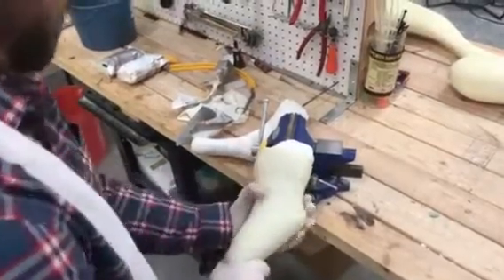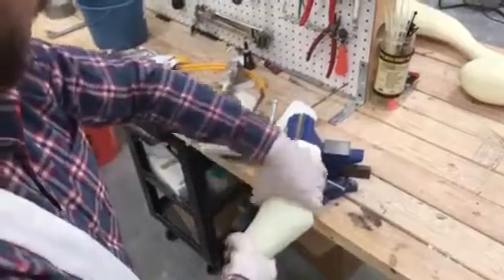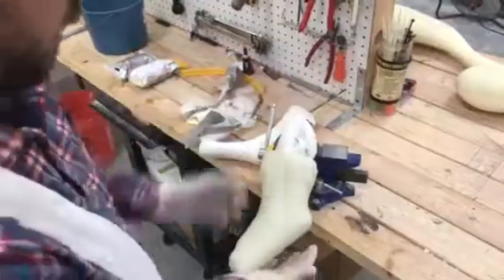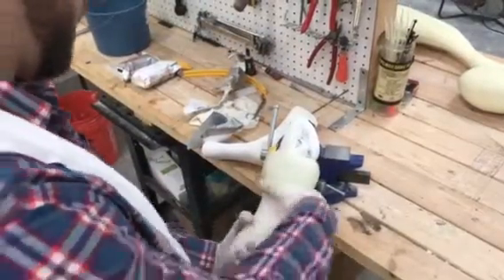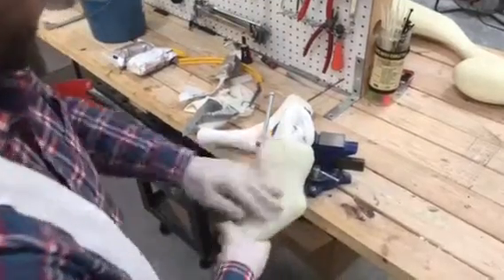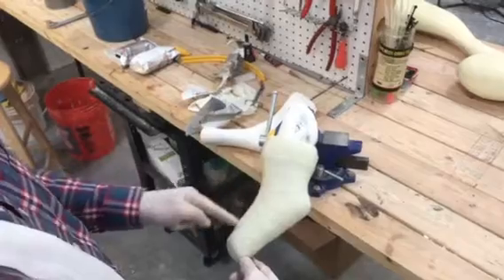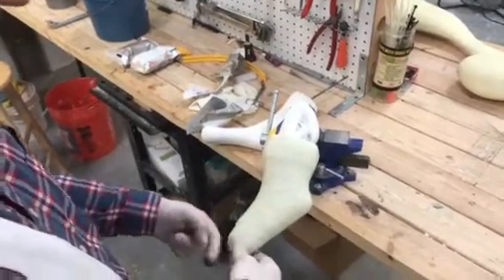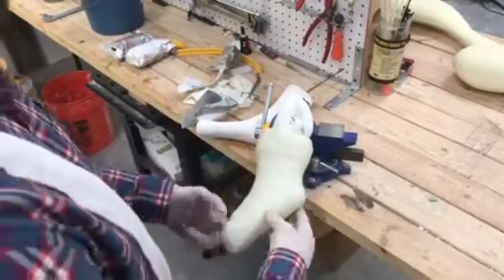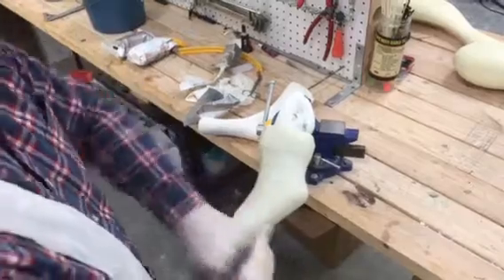I would suggest using three people to cast: one at the head, also holding the stocking up over the shoulder, and the other holding the bottom part of the dog so they don't move. So again, we want to have this 45 degree angle, we want to have the cut strip away from the bottom portion of the leg, and we want to do a longitudinal wrap when applicable so that we get a really good encompassing mold of the distal end of the stump.